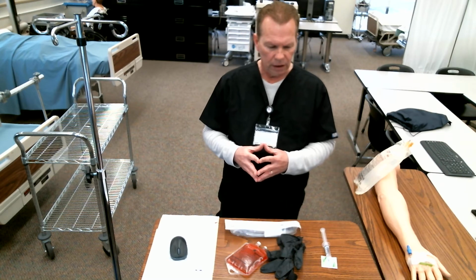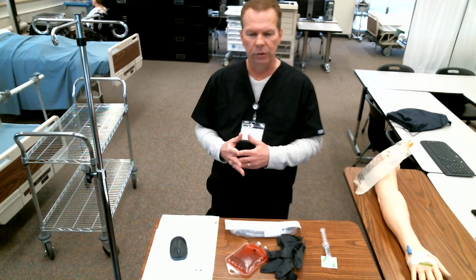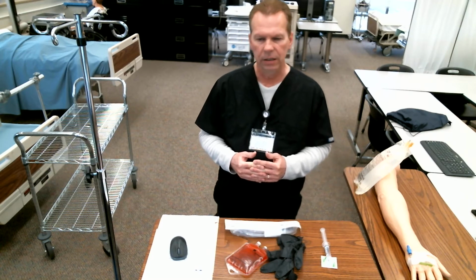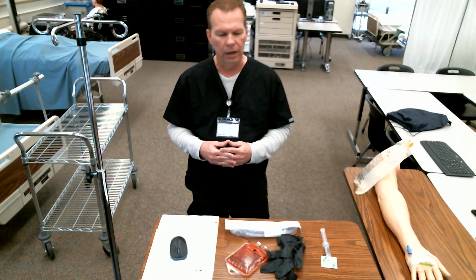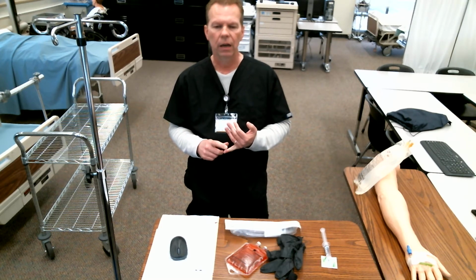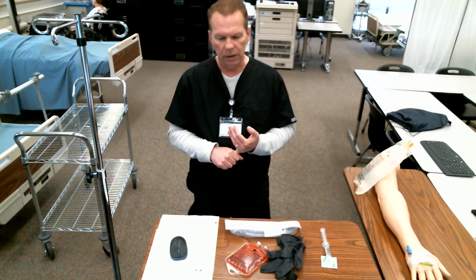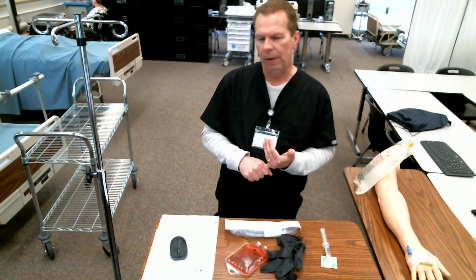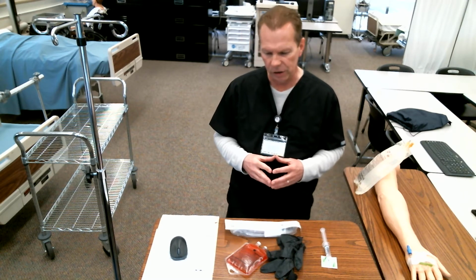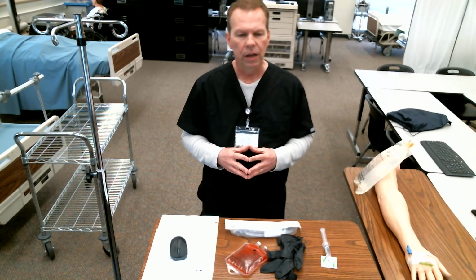There are lots of different types of blood products: whole blood, packed red cells, plasma, platelets. I mean, the list could go on and on. We want to make sure that whatever we get, that we are safe for these products. So to get started, there's about 8 things that I always like to teach my students and make sure that you verify and check so that everything goes well and we keep the patient safe.